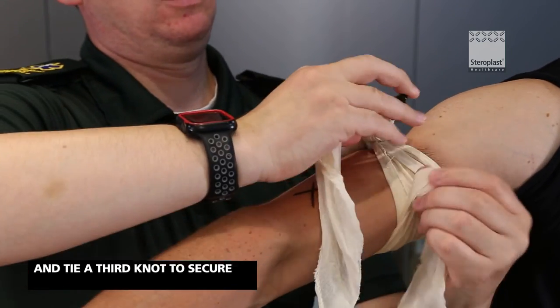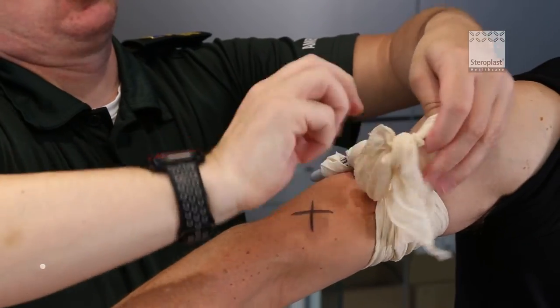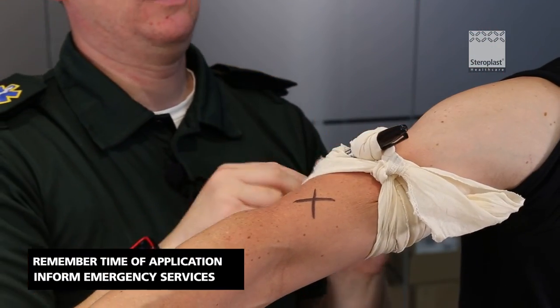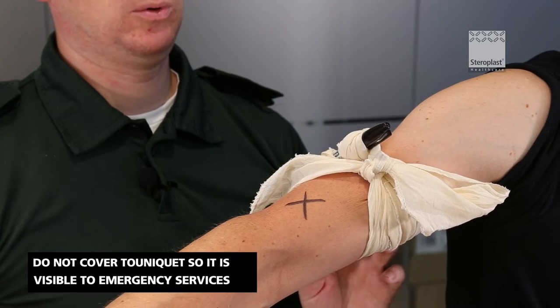Come back under and tie a knot to stop it moving. Once you've applied the tourniquet, make sure you know what time you applied it and either write it on the bandage using another pen, or just make sure you tell the emergency services when they arrive so they know what time it was applied.